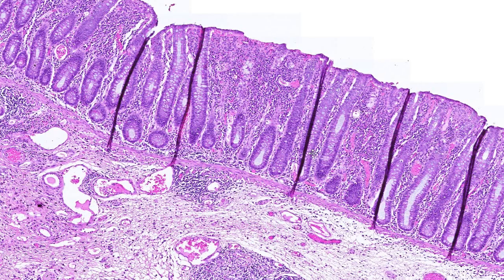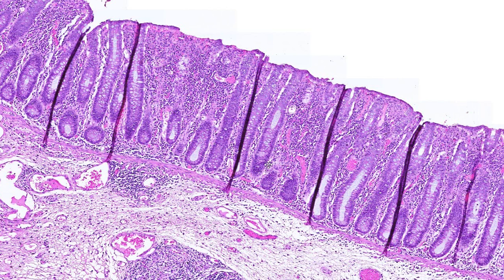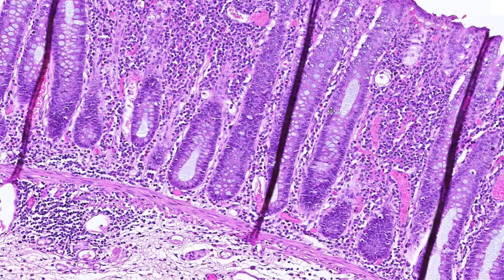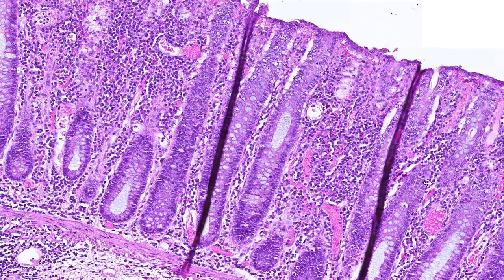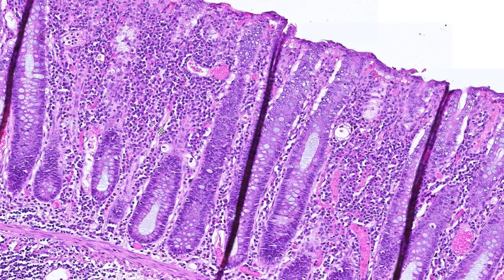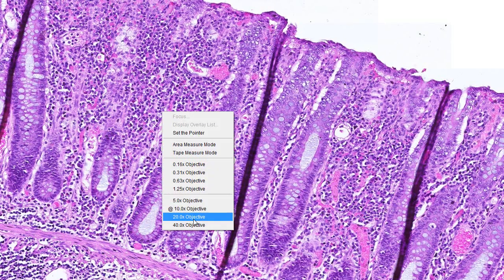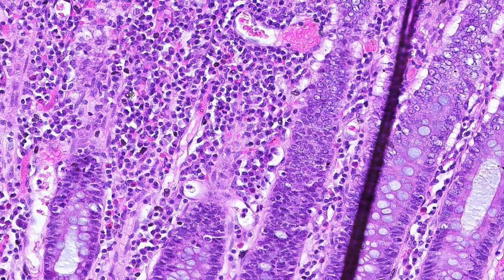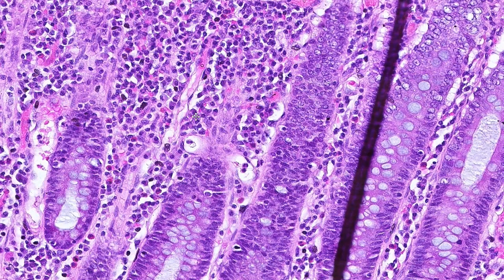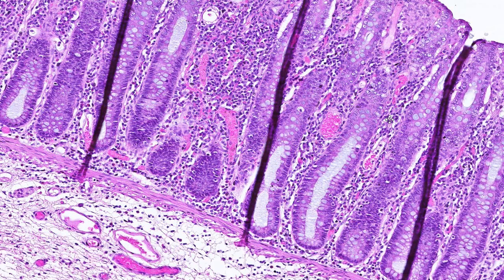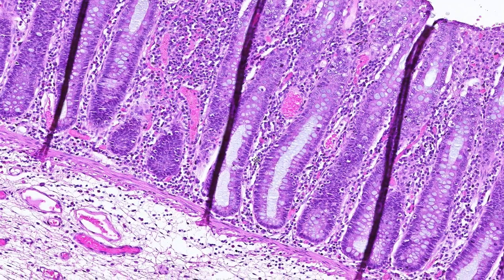If we come up and take a look at the mucosa, we see the normal epithelial cells of the colon, which contain abundant mucin. These mucin-filled cells we call goblet cells. We also see the lamina propria of the colon mucosa. The lamina propria typically contains inflammatory type cells: lymphocytes, plasma cells, and occasional eosinophils.